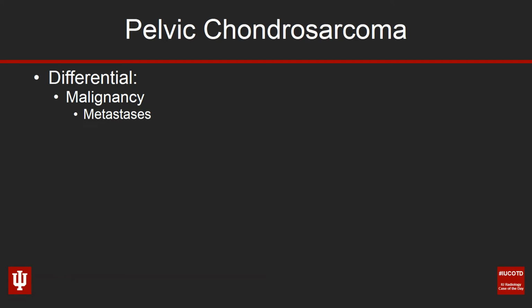Metastases are the most common malignant tumor of the pelvis, and multiple scattered lesions, as well as lesions suspicious as the primary malignancy, would make metastasis even more likely as the diagnosis. Myeloma and osteosarcomas are the top two most common primary malignant bone tumors, but the chondroid matrix argues against them in this case. Other sarcomas, such as malignant fibrous histiocytoma and fibrosarcoma, are not uncommon, but more so involve the iliac bone and proximal femur. They're pretty rare in other parts of the pelvis.